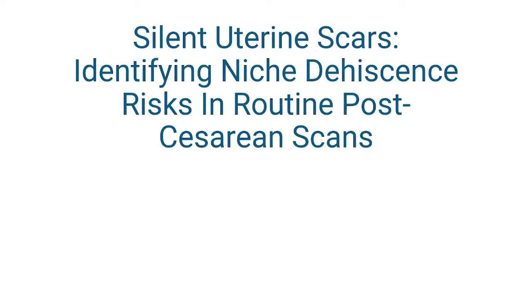Silent uterine scars. Identifying niche dehiscence risk in routine post-cesarean scans. Let's talk, ladies and gentlemen. Do you know what are called niche dehiscence risks in routine post-cesarean sections?